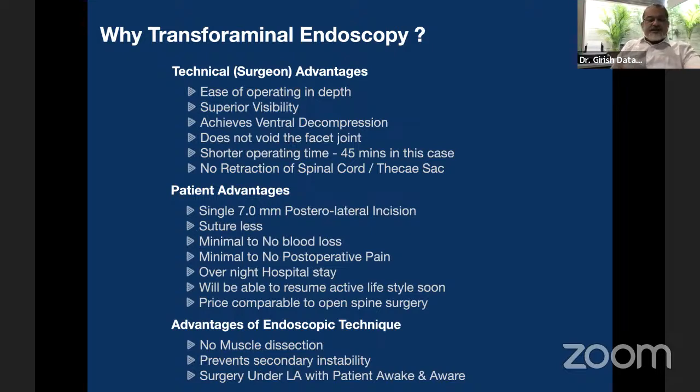The patient advantage is that it's a single posterolateral incision, which is small and sutureless. You just get away without any suture. There is minimal to no blood loss. Post-operatively, there is not much pain. The patient may stay overnight if you feel so, and is able to return to an active life very soon. Price is comparable to open surgery. It's not very expensive.